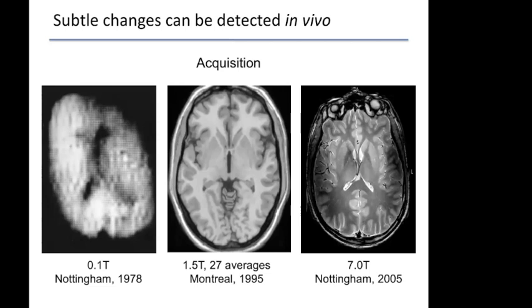Unlike the transition from 1.5T to 3T, we haven't really worked out the software for analysis. So if you're interested in the magnetic resonance imaging signals, or in detailed physiology questions, that is an excellent place to start. If you really want to look at subcortical structures in great detail, that could be a really good place to start. What my colleagues who work in 7T suggest is: have a question that you want to go into detail on, try looking at that through the lens of the 7T, and then try to apply that to understanding what the signals at 3T are telling you, if you want to get some sense of specificity.